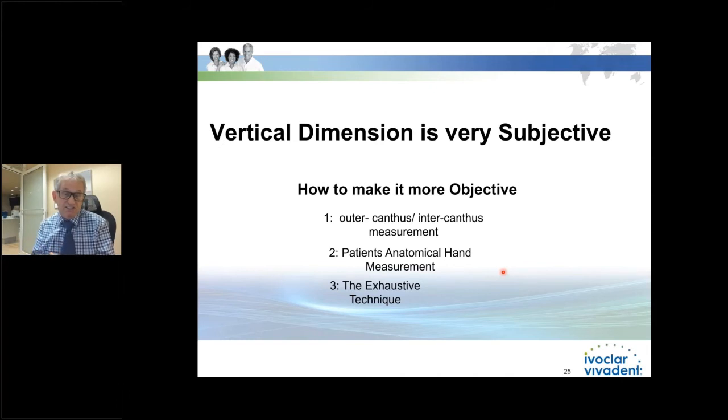Let's say I get 67. I'm going to take the 62, the 65, and 67. Guess what number I'm going to take? I'm going to do the average. So I'm going to take the average of the three, and you've got to remember this is going to be an initial vertical. So it doesn't have to be exact.